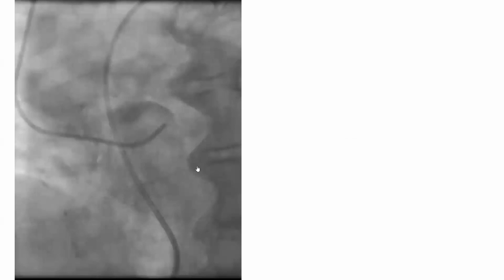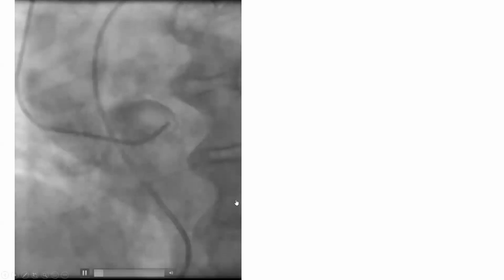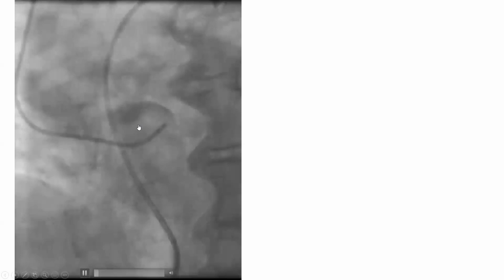I have several cases. So this is the first case. We kept trying to engage the left coronary here on the left sinus with no success. In those difficult cases, what you should do in general is do a non-selective cusp injection in an LAO view to help gauge whether the takeoff of that left main is from the left cusp.